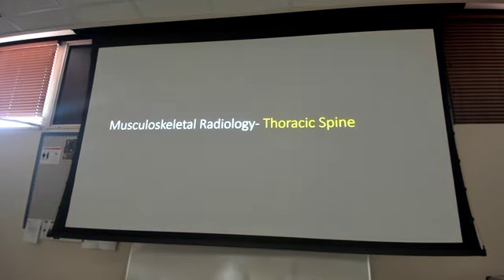All right. Questions on the cervical spine? Yes, sir. I think for both of these, is there any clinical value in the patient positioning, like supine versus standing, load bearing, something like that? Yeah, not necessarily. Most of your spine x-rays are done lying down, unlike the knee and the ankle, because of the discs, there's not really a huge benefit to making sure they're weight bearing. So normally it's just a lying down one, that's the standard protocol. Yeah, good question. Anything else on cervical spine?